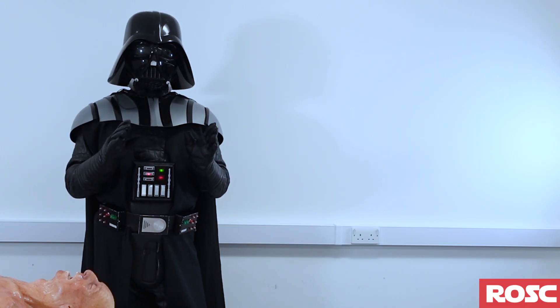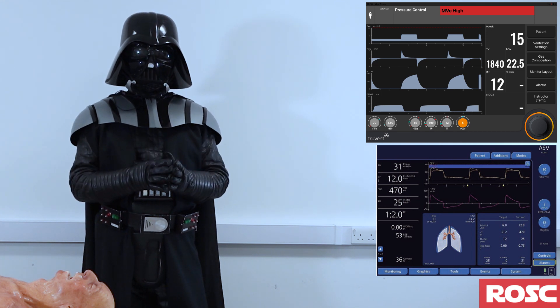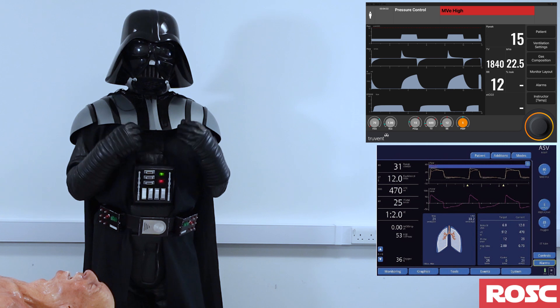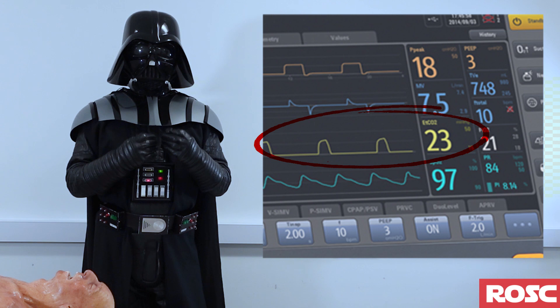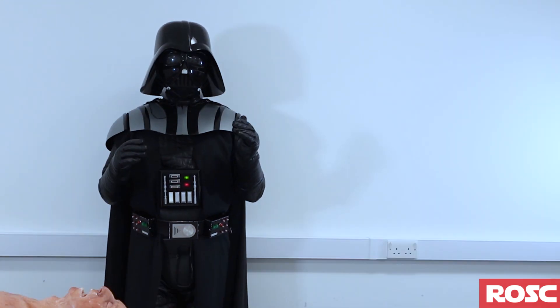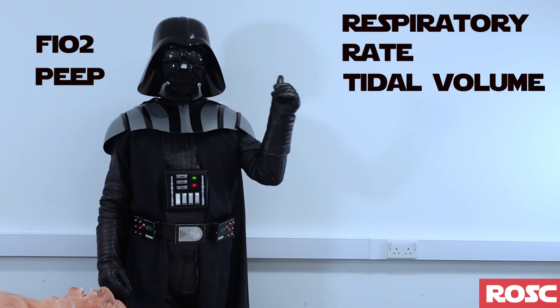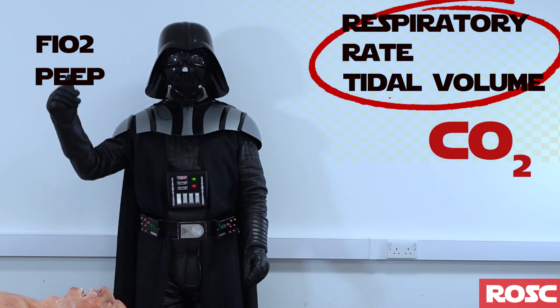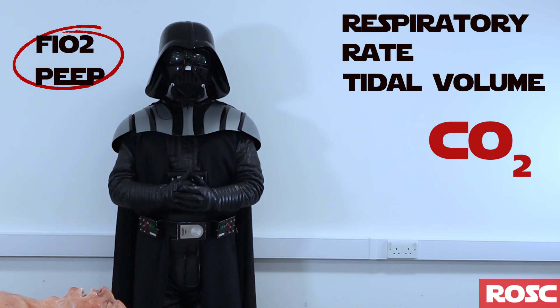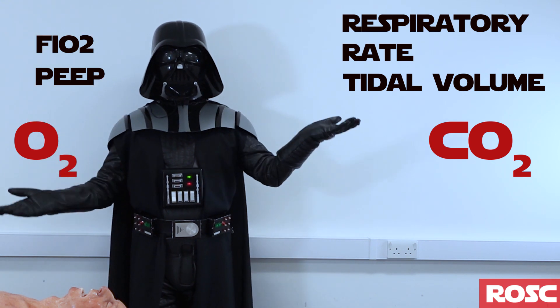You may feel slightly overwhelmed by all the different values on the monitor and not know which is most important. In my humble opinion, the most important value in the pre-hospital setting is ETCO2 — that's the value you should focus on. The first two parameters, respiratory rate and tidal volume, are going to affect carbon dioxide; the last two, peak pressure and FiO2, are going to affect oxygenation. So we can manipulate those values to get the effect required.